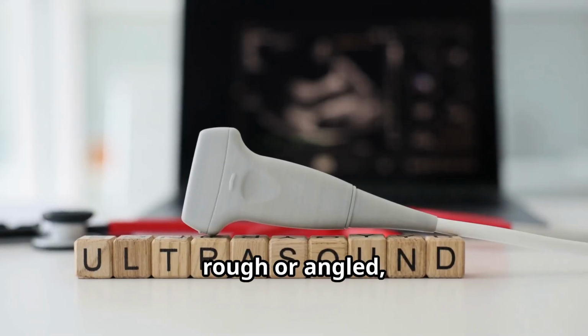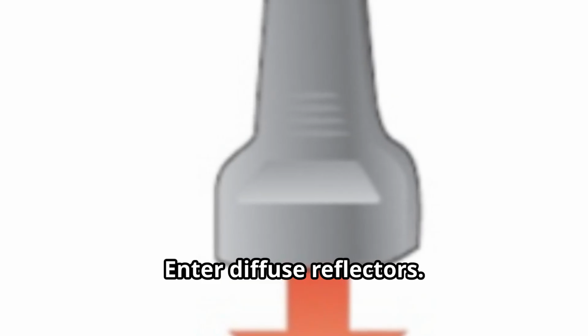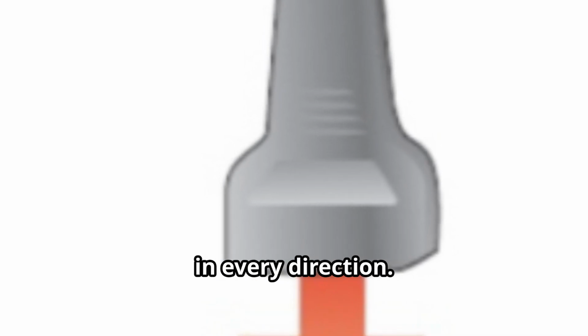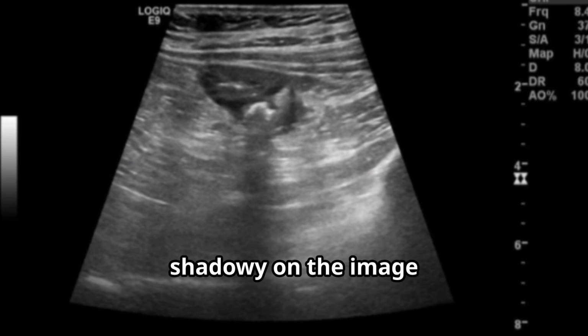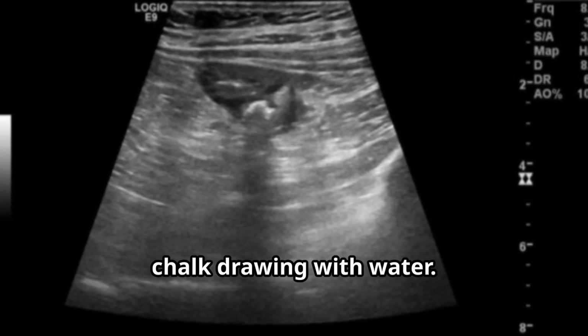If the surface is rough or angled, things get tricky. Enter diffuse reflectors. These scatter sound in every direction. Only a little returns to the probe. Those boundaries look blurry and shadowy on the image, like washing out a chalk drawing with water.